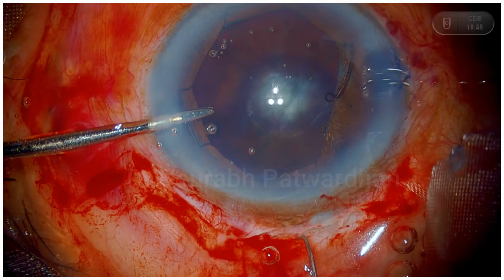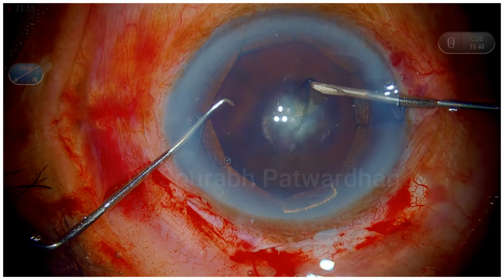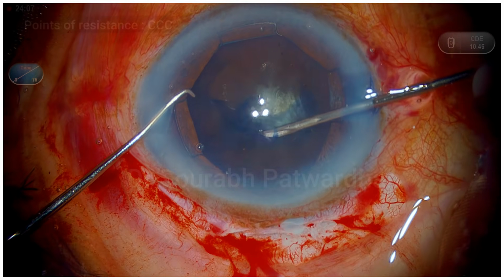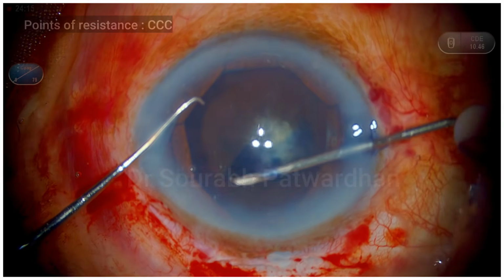under the iris there, and it's nicely tucked in, and you can see now I have got a large, almost 7.5 to 8 millimeter pupil, which is extremely important because now I am going to tackle the next point of resistance, which is the capsulorhexis.